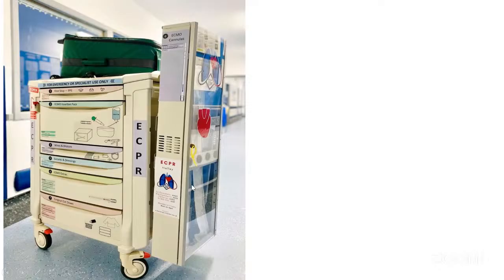This part contains the multiple cannulas which can be used according to the patient. Initially, you can have some gowns, surgical gowns, and ECMO insertion packs. In the second part you have ECMO insertion packs, which will have your guide wires, cannulas, dilators, and the bags, perfusion cannula. Wires and dilators are kept here, and sutures and dressings are kept here, and ECMO extras. If you need extra needles, extra dilators, or cannulas, those will be here. Surgical cut down, if required, is here.